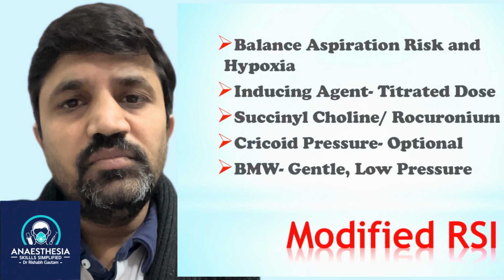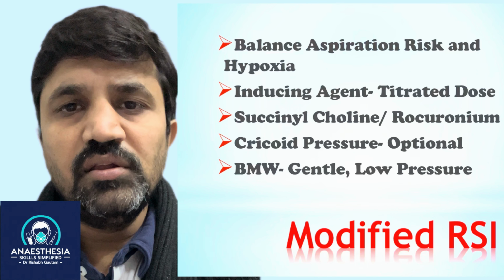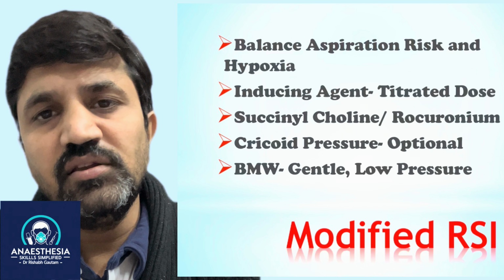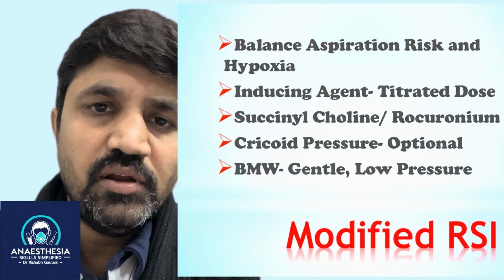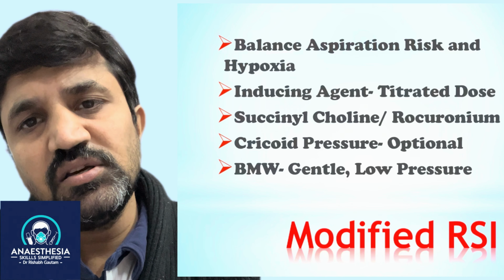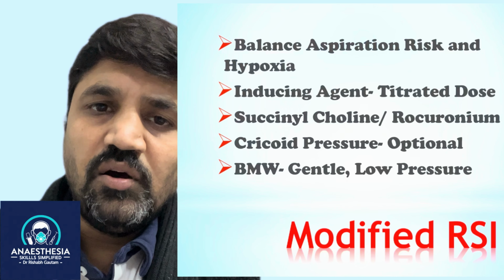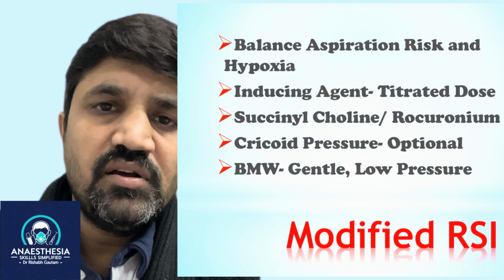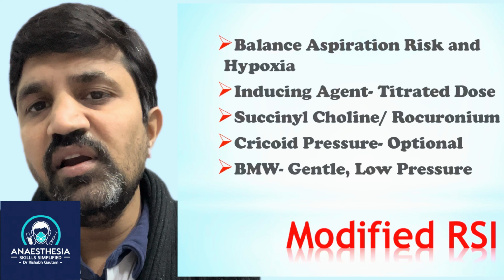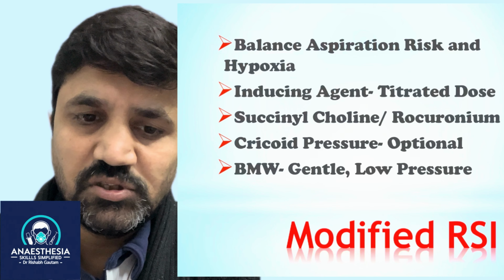There is a very common term called modified RSI. What is this? Modifications are made in the classic RSI approach to improve the outcome of RSI, and this modified protocol is called modified RSI. The modified RSI balances the risk between aspiration and hypoxia. In classic RSI, all the doses given are premeditated and pre-calculated doses, but in modified RSI, the induction agent is given as a titrated dose.